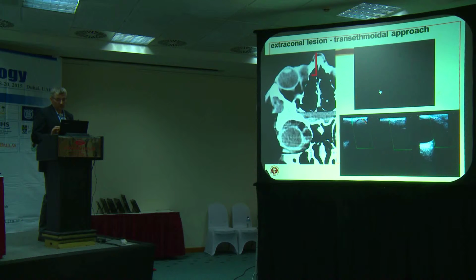If there are fluid or semi-fluid lesions, we always perform ultrasonography at the end of the operation to confirm that the whole lesion was removed, because sometimes we have separate patches of fluid, and they are supposed to be resected in the same procedure.